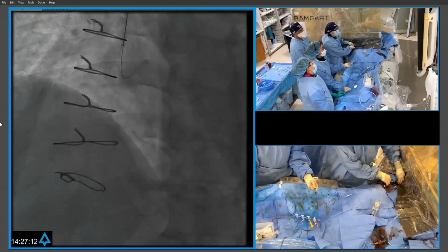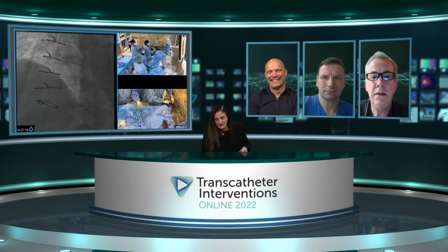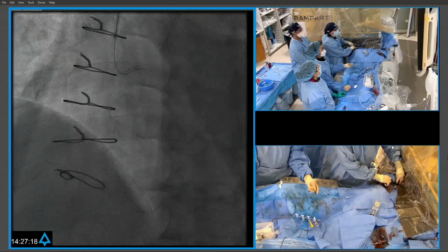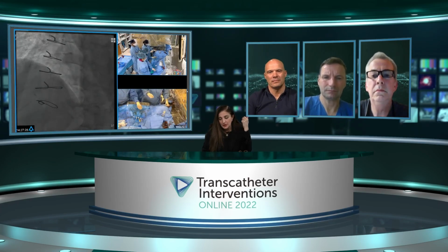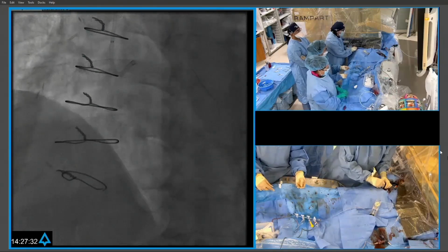No, I didn't say that. This is a pretty complex CTO. There's no question about it. But I just think it's just amazing watching this. And maybe Ajay, while Margaret is working, you can tell us about your first wire, your guide selection, all of that. It will really help the audience.